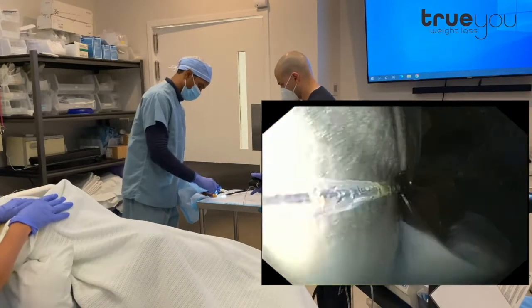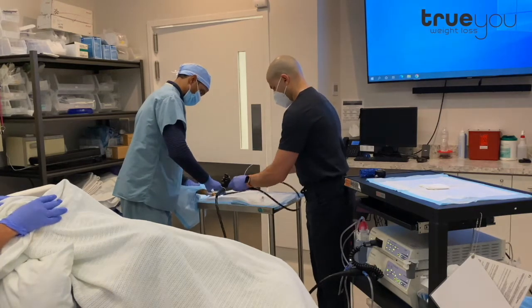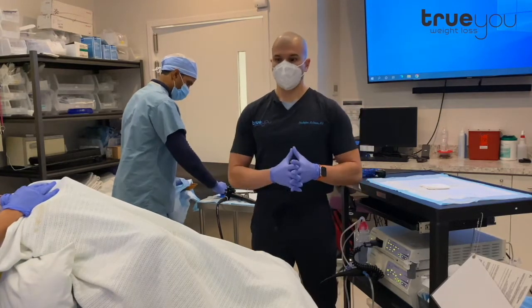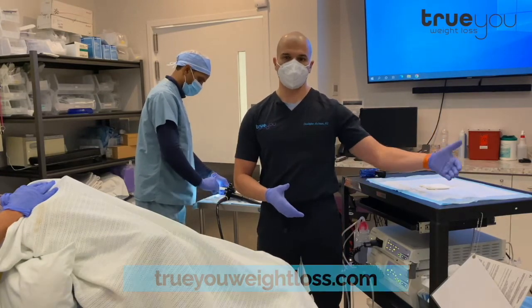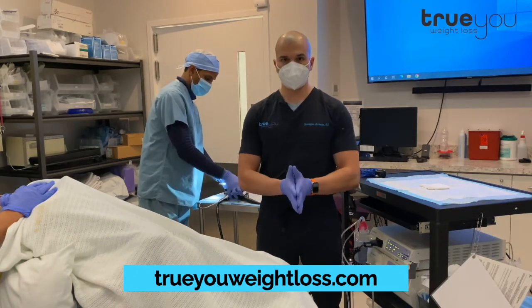We'll detach this from the scope, she will wake up, and then she'll go home. So that's an Orbera removal — it takes about five minutes. The patient will go home and she'll continue to work with us for six months to make sure she's keeping the weight off. Most patients will actually lose more weight over the next three months because they've continued all of those healthy habits. And that concludes the procedure.